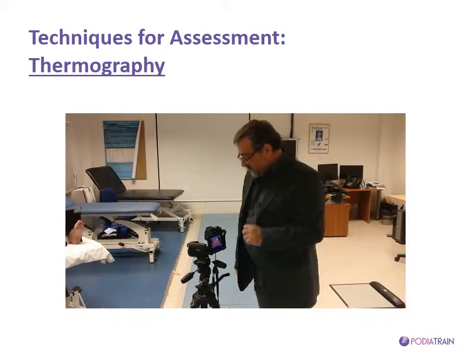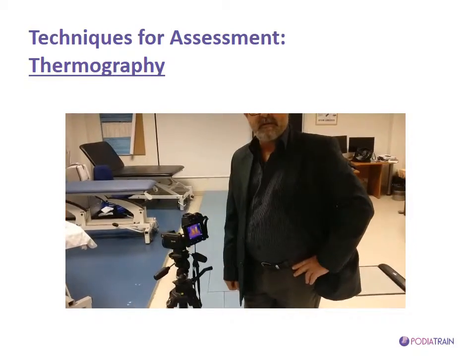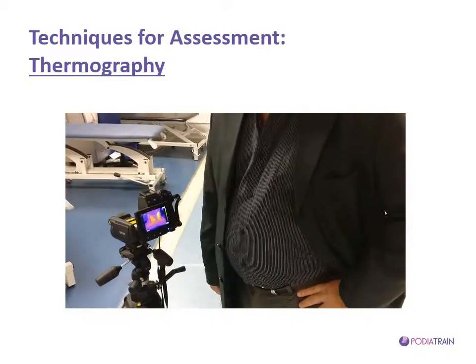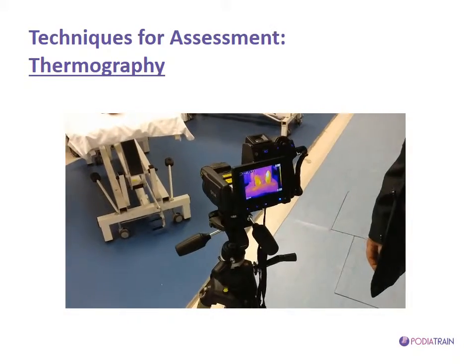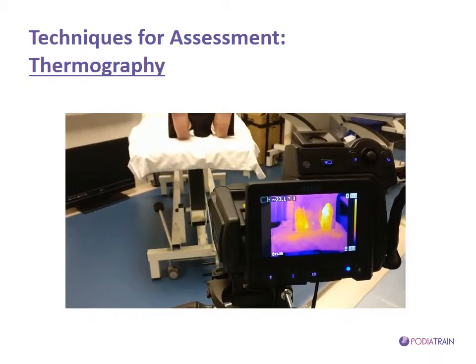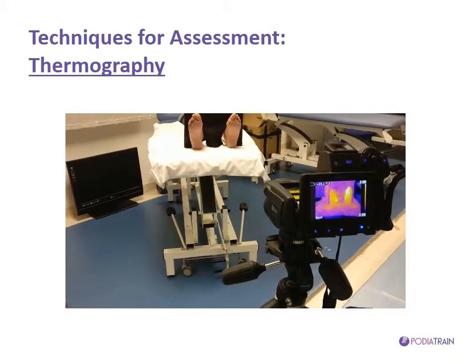So at this part of the examination, we are going to apply quite an innovative technique, which is called thermography. Thermography, or medical infrared imaging, is an emerging technology which has quite a lot of potential applications in the assessment of the diabetic foot. This type of technology measures heat which is emitted by any object, or in this case the foot, which is above absolute zero.